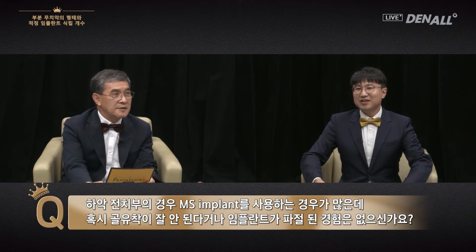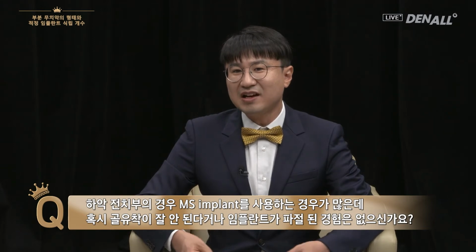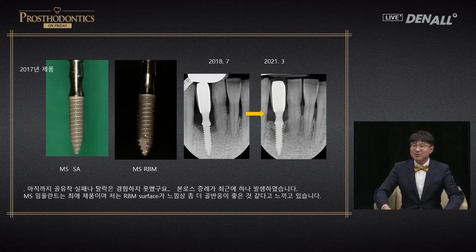I really like MS implant. It is very unique and well designed, and drill coordination is very well done. I honestly have never experienced any failure with MS implant. Up until recently, I talked about how I never experienced bone loss with MS implant. And right after I talked about this in a different program, I experienced bone loss, and at the time I left too little buccal bone and marginal bone loss occurred. If you look at this case, I was concerned about the bone on the superior area.